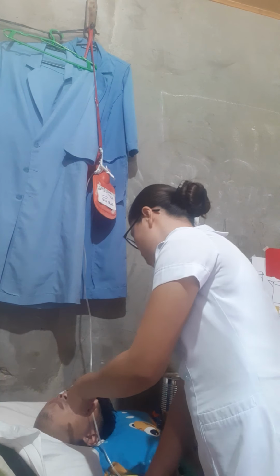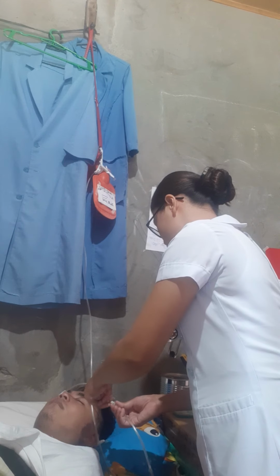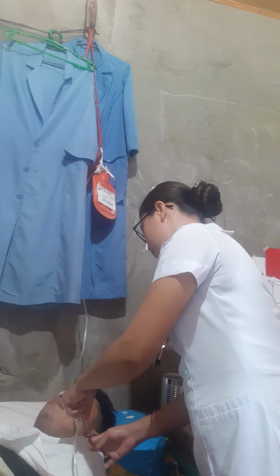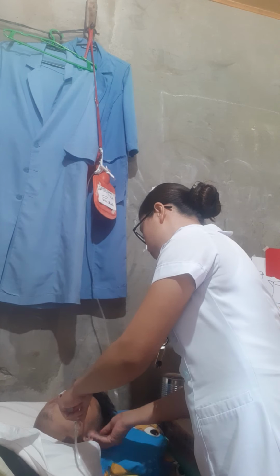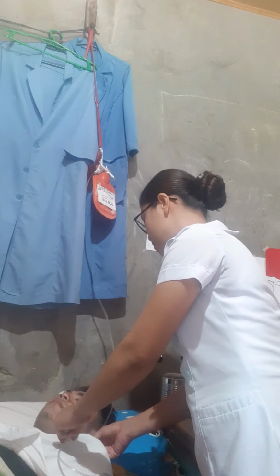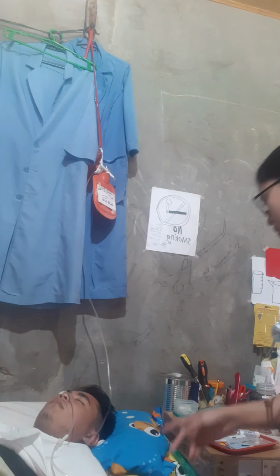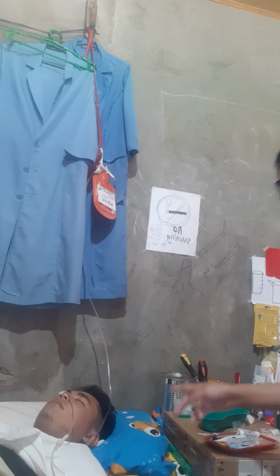So we need to clamp the tubing to the client's gown, so that even if the client moves or accidentally moves, the tubing will not move or be removed. This minimizes pulling of the tube and prevents discomfort and dislodgement.